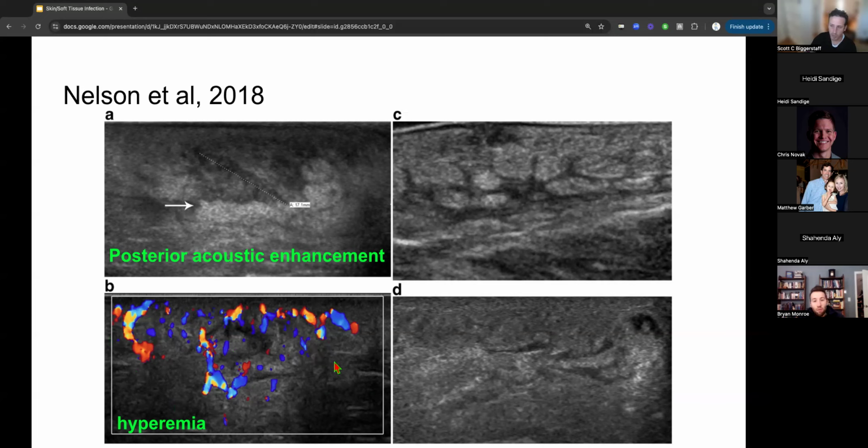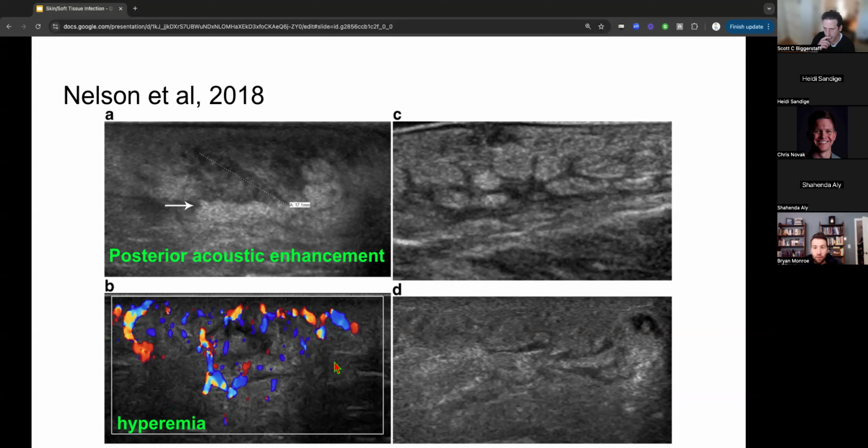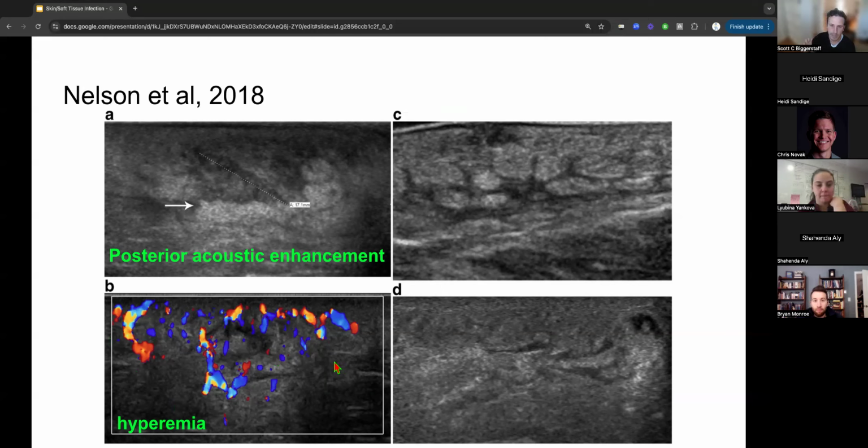That infection produces inflammation, which makes the tissues release these vasoactive substances, causes that more dramatic appearance of those blood vessels surrounding it. Up here is cobblestoning, and then this they called interstitial fluid or tissue disarray, but they recognize that these things exist on a continuum. So in some cases where it's really mild, they would call it interstitial fluid, and otherwise they might call it cobblestoning.